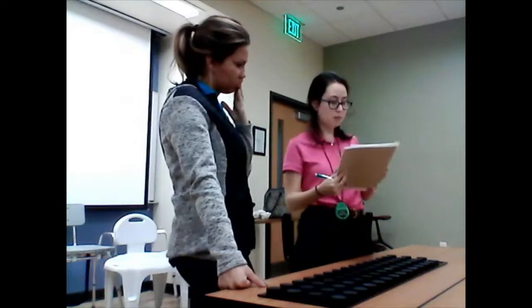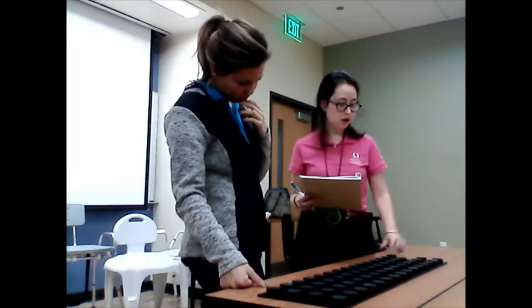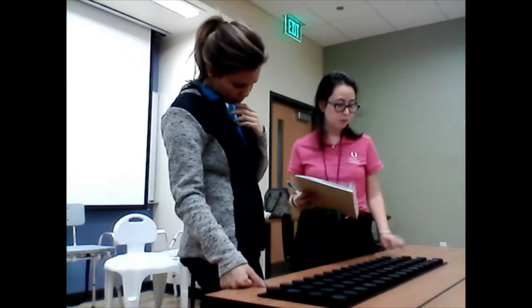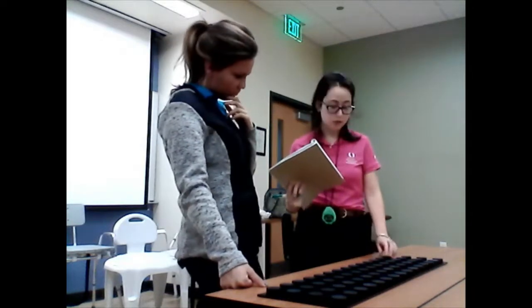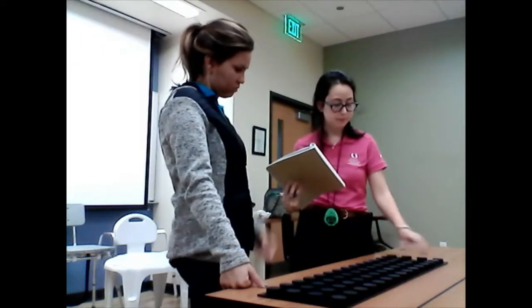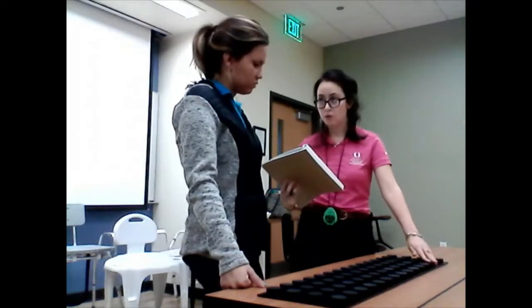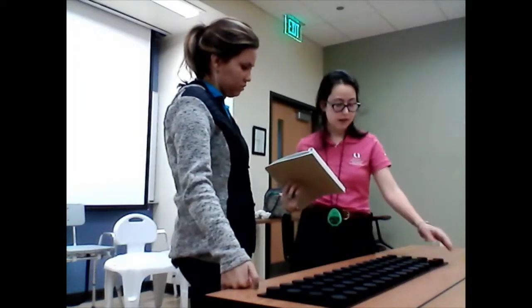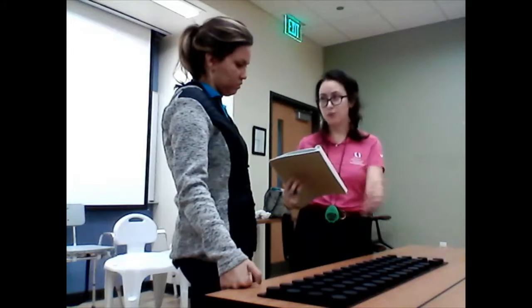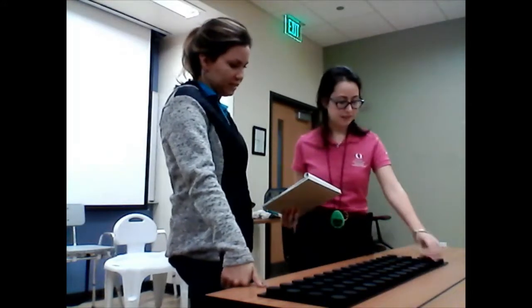You will fill in the top hole with the block below it, and you will continue to work your way up, filling the empty hole. Once you reach the bottom, you will fill that hole with the bottom hole next to it, and continue to work your way through it. Once you reach the top, you'll fill it with the top peg next to it, and you will work from left to right. Is that clear for you? Yep. All right.